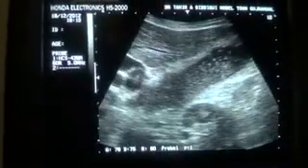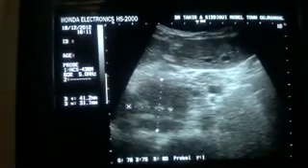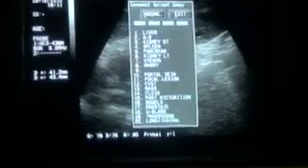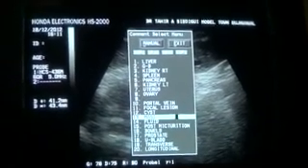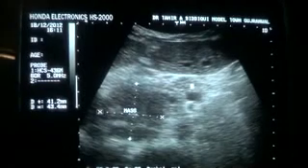And this is the mass — this is the mass at the head of the pancreas.